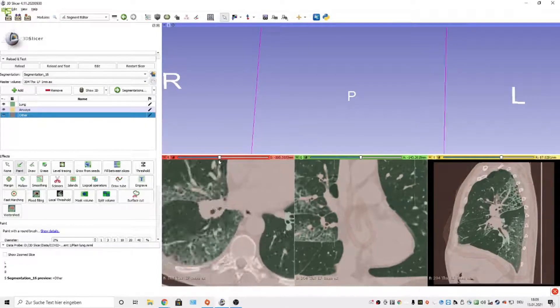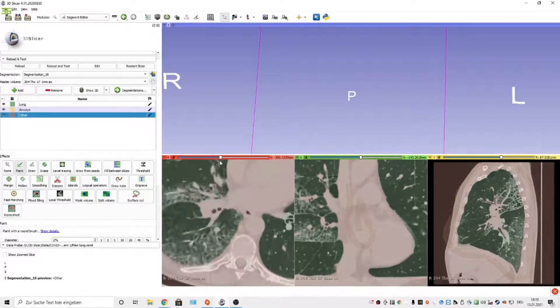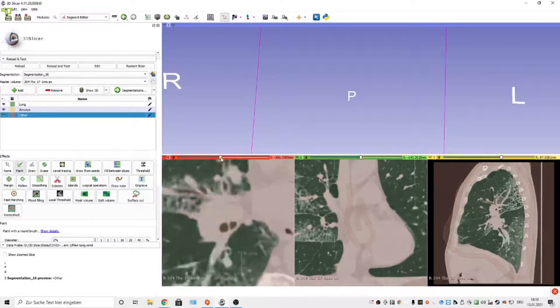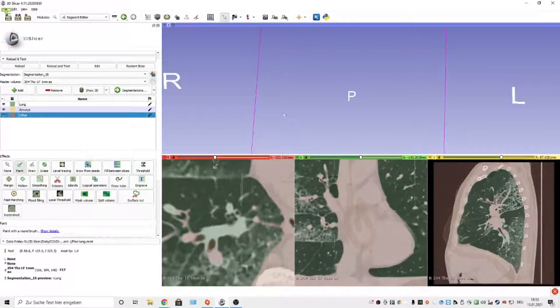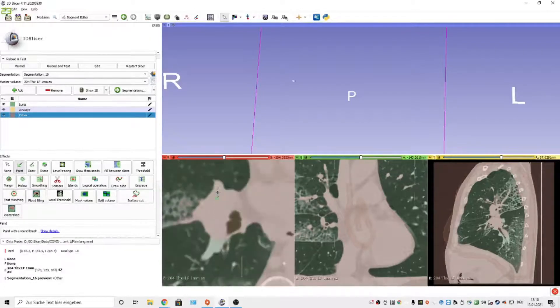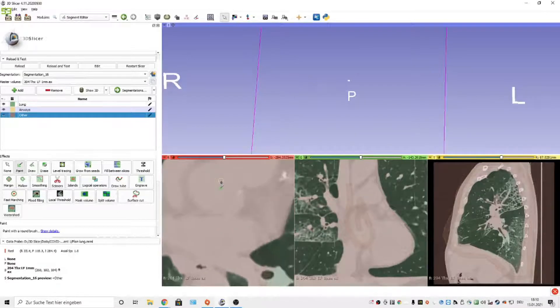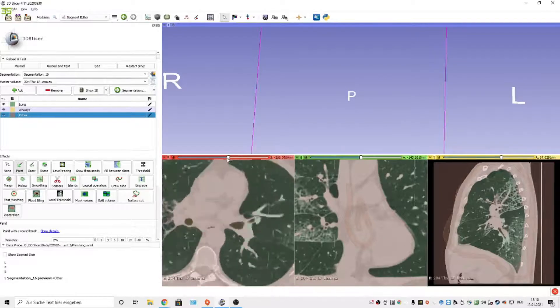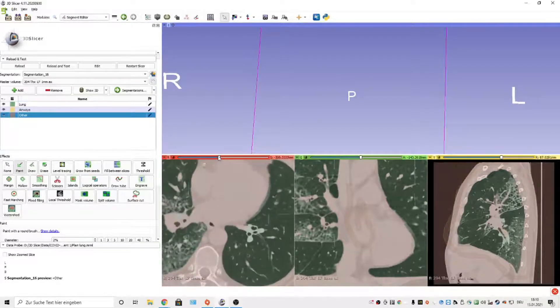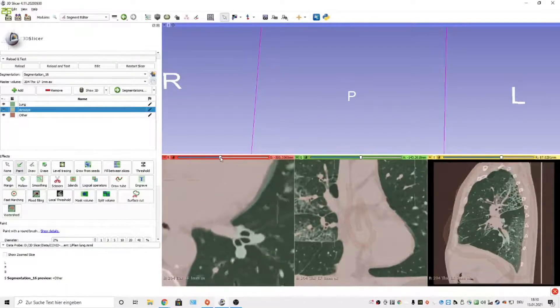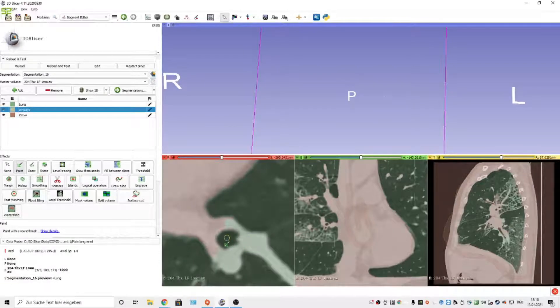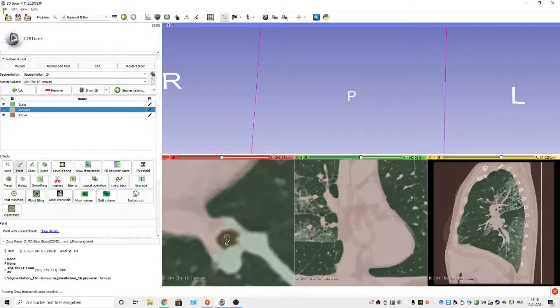Now we check the bronchial airways. There's something missing here, but it's only a small bronchus. But here we've got a problem on the left side. So we will select Airways and place a drop into the missing bronchi. You can do this until you are satisfied with the total results.